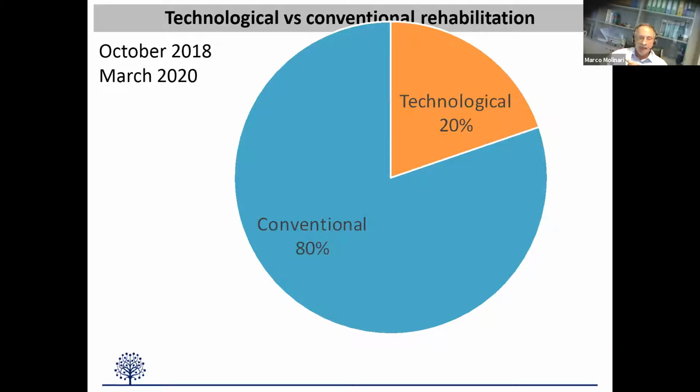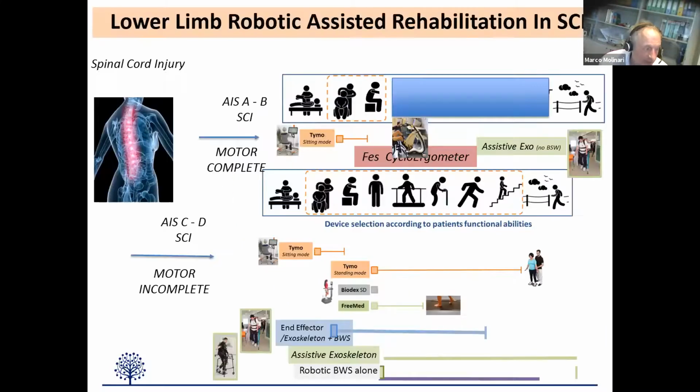applied directly in clinic. It's quite difficult for someone who has been in the business for 20 or 30 years, not using technology, to suddenly start using an exoskeleton or end effector system or virtual reality or new technologies, especially if there is not a specific instruction for the use and indication. Look how much information you get for a new drug. There is not a shadow of this information when a new technology just appears in the rehabilitation department. This is really a gap that we have tried to fill.